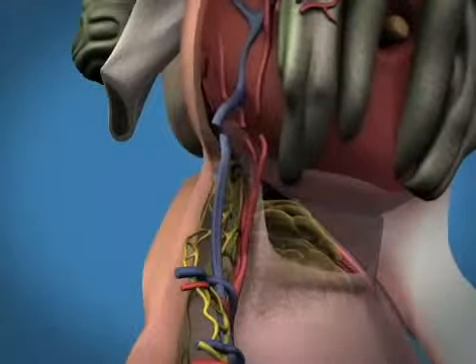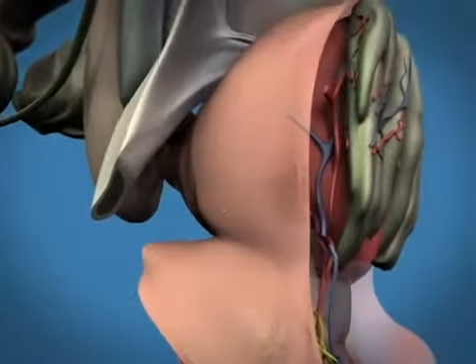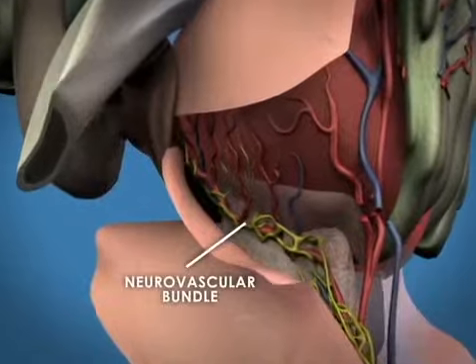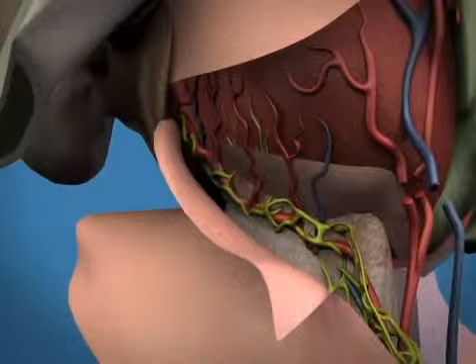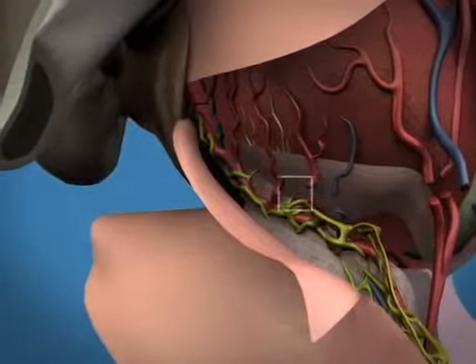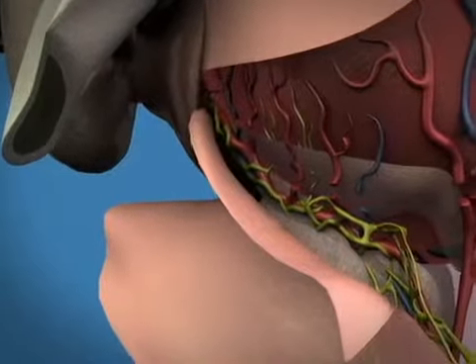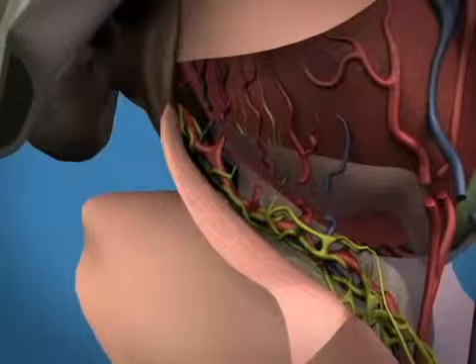Next, the prostate is retracted to one side, and an incision is made in the levator fascia over the neurovascular bundle, exposing the neurovascular triangle. This provides an initial release of the neurovascular bundles. The neurovascular triangle is entered and the bundles are released by cutting close to the prostatic fascia, as blood vessels in this section are secured and cut. Once completely released, the bundles fall away from the apex. This procedure is repeated for the neurovascular bundles on both sides.